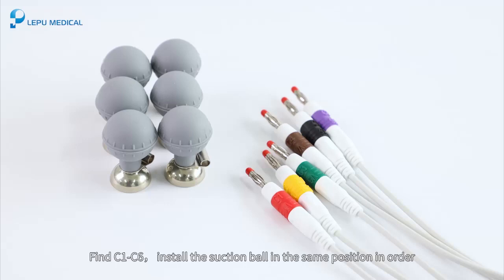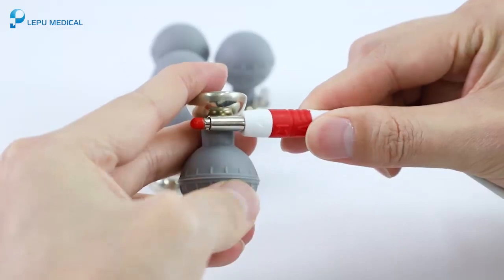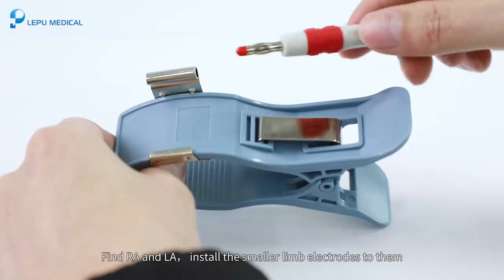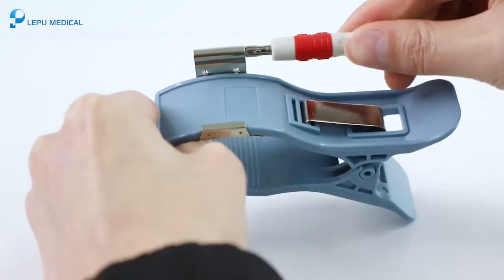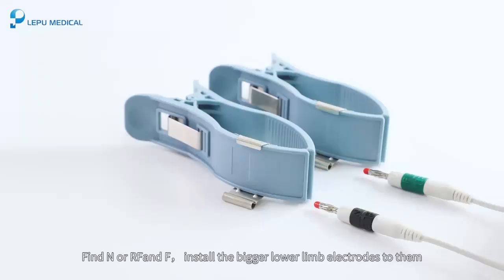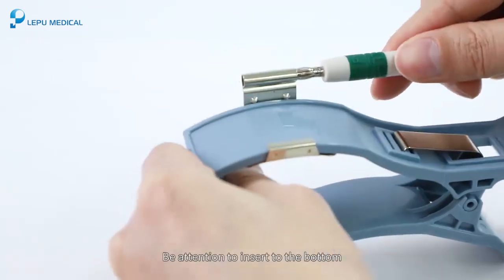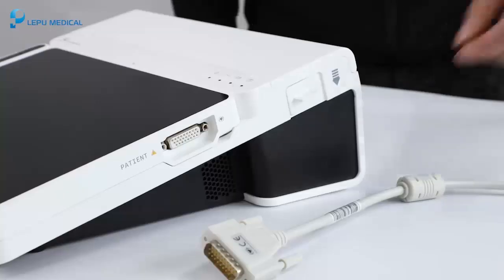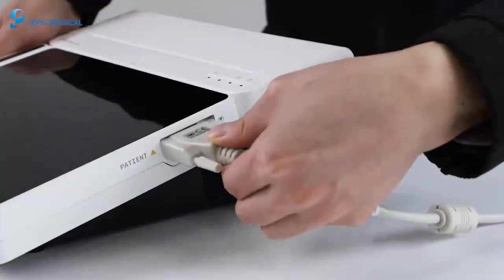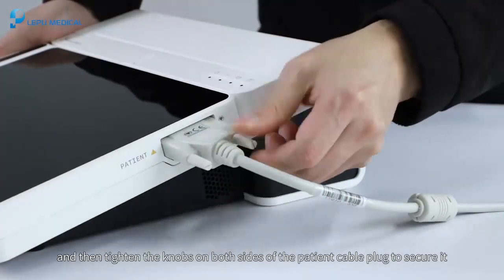Find C1 to C6 and install the suction ball electrodes in the same position in order, being careful to insert them to the bottom. Find RA and LA, and install the smaller limb electrodes to them. Find N or RF and F, and install the bigger lower limb electrodes to them, being careful to insert to the bottom. Connect the patient cable to the patient cable connector of the device, then tighten the knobs on both sides of the patient cable plug to secure it.